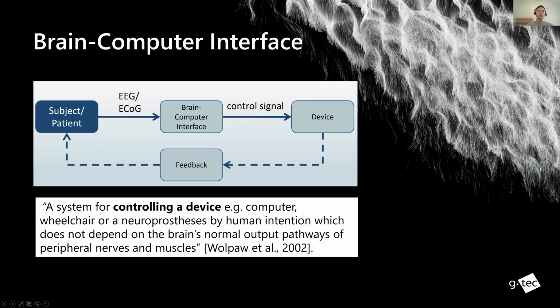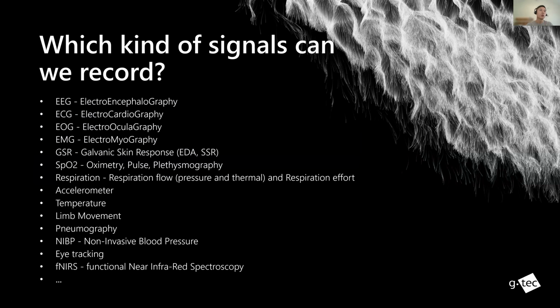Let's see what types of signals we can record. Traditionally or originally, an amplifier records only EEG. But of course, EXG is now enabled. A lot of people are doing those for additional control signals. Let's say EMG: you can just place it, say, on a finger triggering motion, then you can already form another type of control signal. So lots of research labs are starting to integrate more control signals.